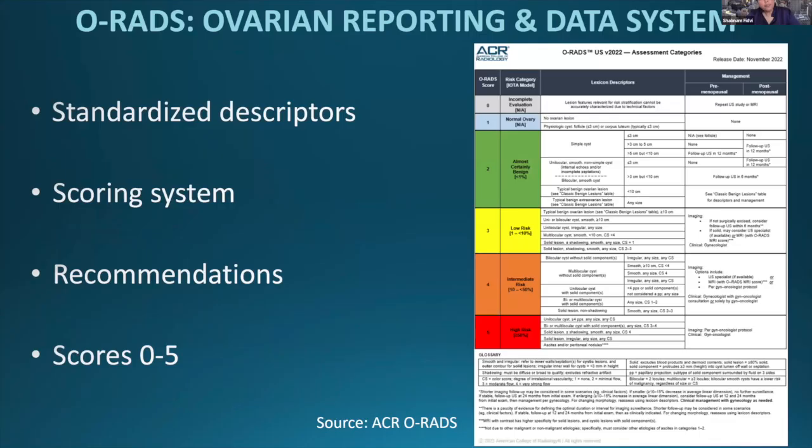I do want to touch briefly on O-RADS, which is the Ovarian Reporting and Data System. There's an O-RADS ultrasound version as well as an O-RADS MRI version. The latest update was in 2022 by the ACR. A comprehensive review of O-RADS is beyond the scope of this lecture. And full disclosure, we don't use O-RADS in our practice, but it might be something that you want to learn more about. So with my slides, I've included resource information that you can feel free to visit in your own time should you want to.